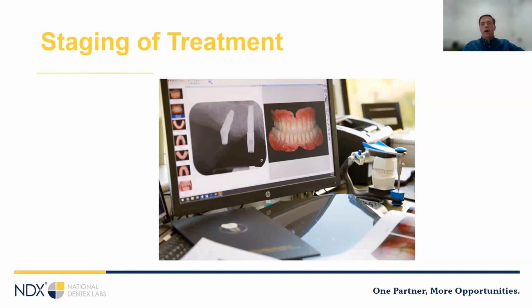Sometimes there's more than one option. Let's say we have to do a single anterior implant. It could be that an immediate provisional would be the best solution for the patient in terms of giving a nice ideal tissue contour, but maybe a cover screw and a flipper would be more affordable. So we share those both with the patient, and the more we get the patient involved in this process, the more buy-in they have. So it's not my bad idea as the treatment professional, but it's their idea. And so therefore, for most of us, if we think it's our idea, it makes it intrinsically better.